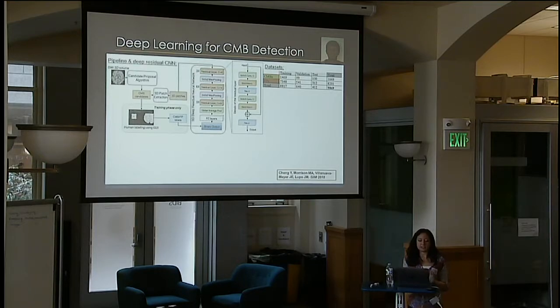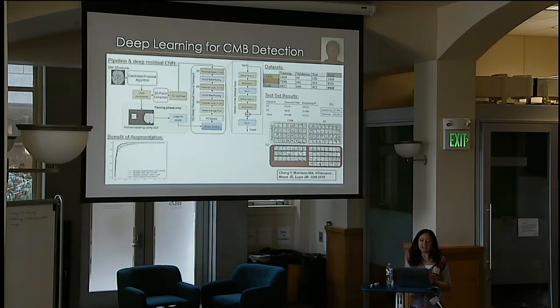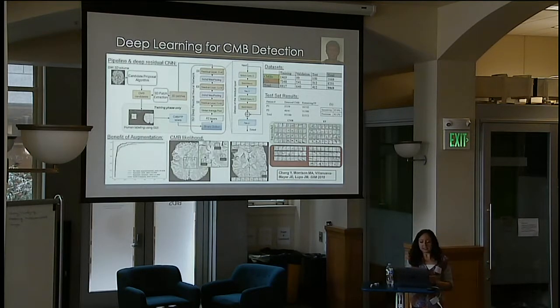And we train this on about 100 patients with several thousand microbleeds this way, and even more false positives. You had to do all sorts of data augmentation, and in the end, we're able to greatly increase our specificity. And now, instead of having 50 plus microbleeds, or sorry, false positives per every patient, we're now down to 10.